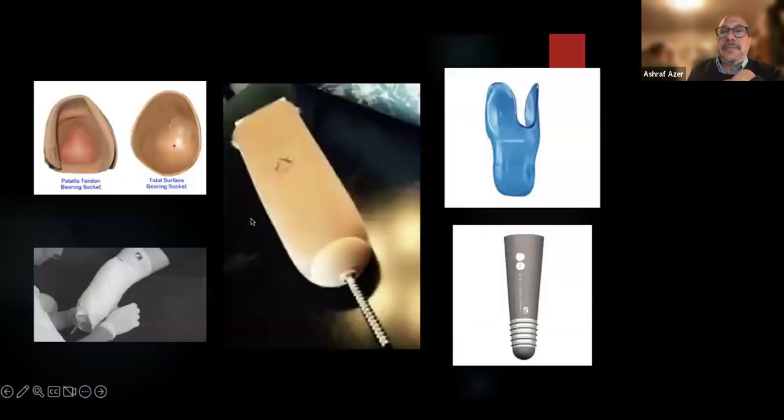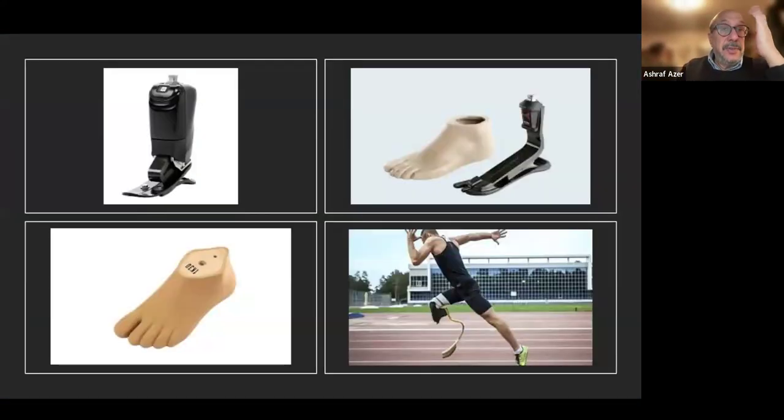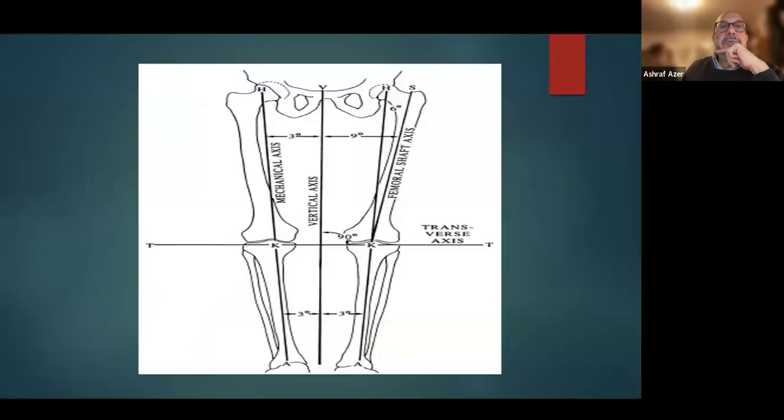So now you describe what you call it, the lower end. You have a transtibial amputation with you. You commented on the stump, on the liner, on the incision, on the problems you have seen, on the type of socket, type of foot, and then you ask the patient to walk and describe what sort of gait he has. Simple as that. And now you have the marks all in your pocket. Okay, now let's talk about the transfemoral.